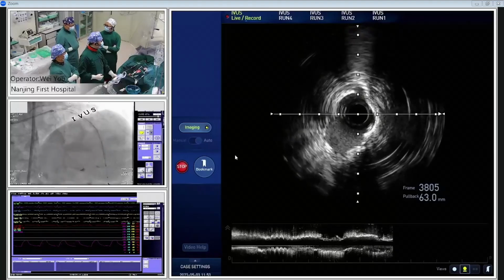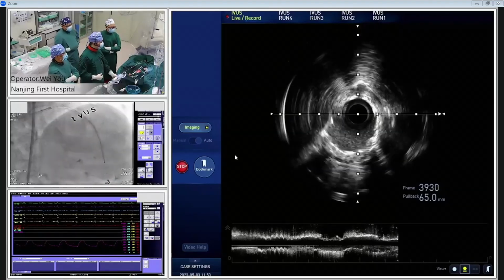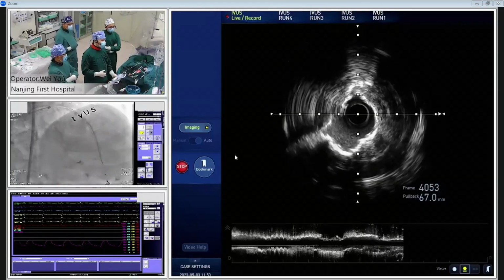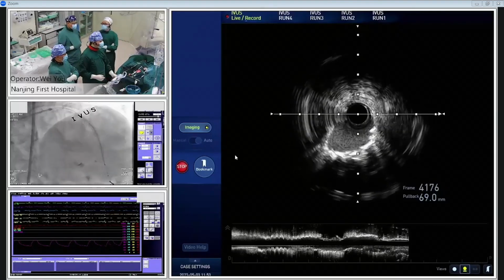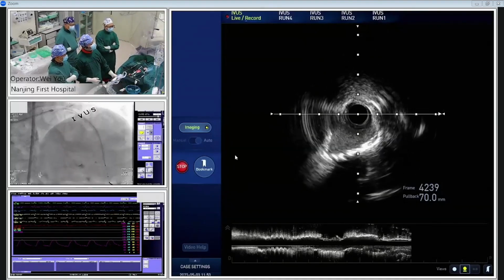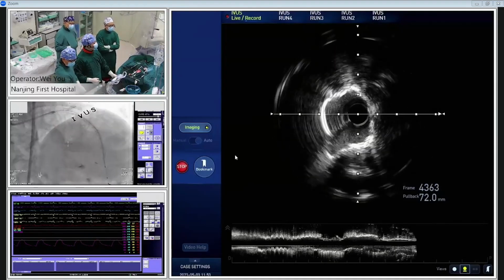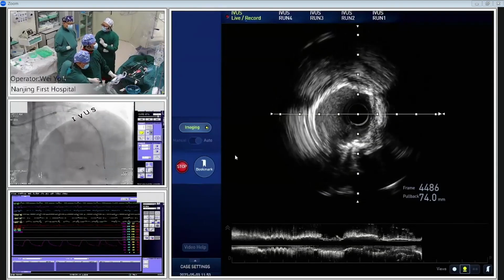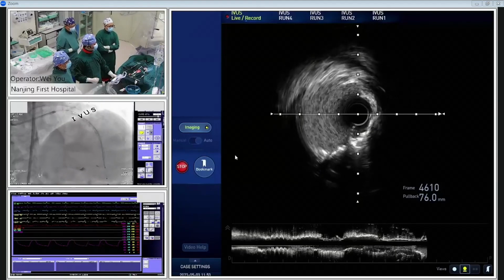I think the majority of the contribution is the severely calcified lesions. Now that IVL is available, the optimal achievement rate may be higher compared to previously. So for big vessels with severe calcified lesions, we need rotablation combined with IVL. Maybe it's the best choice for lesion preparation. I think so. Hybrid therapy.